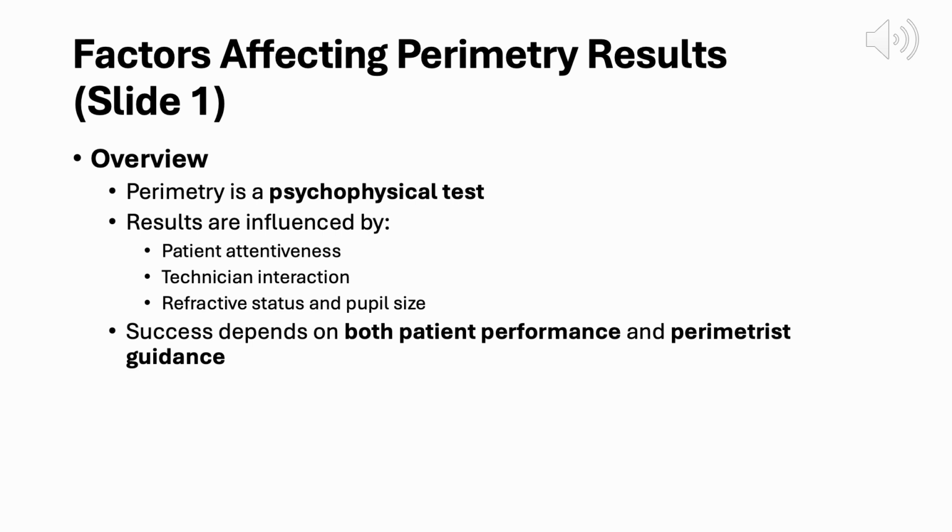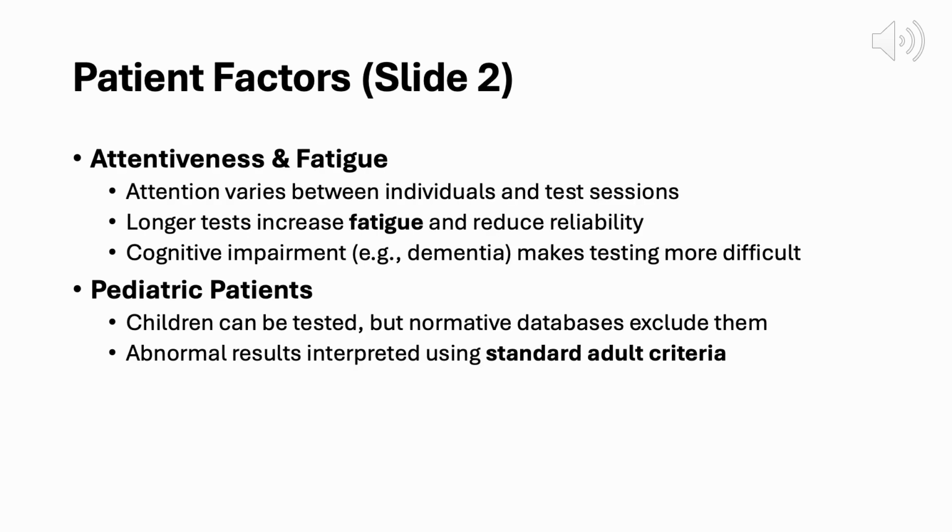Ultimately, successful perimetry hinges on both the patient's performance and the perimetrist's guidance. Their combined efforts directly impact the validity of the results. This slide expands on how patient-specific factors affect perimetry quality.